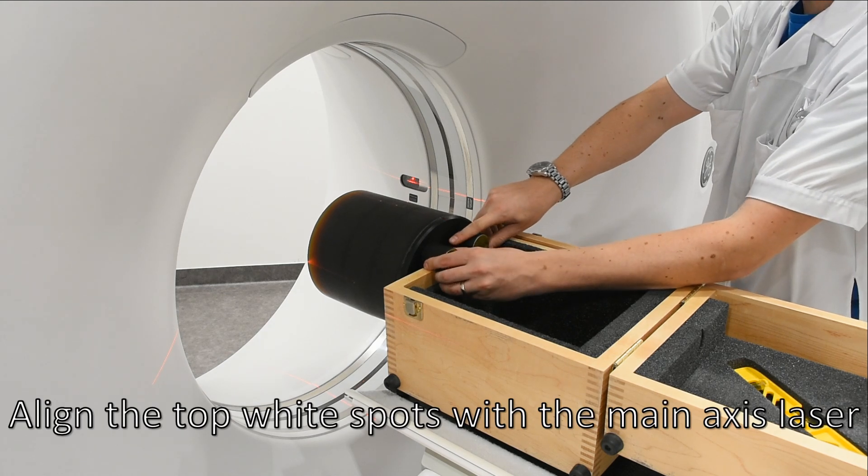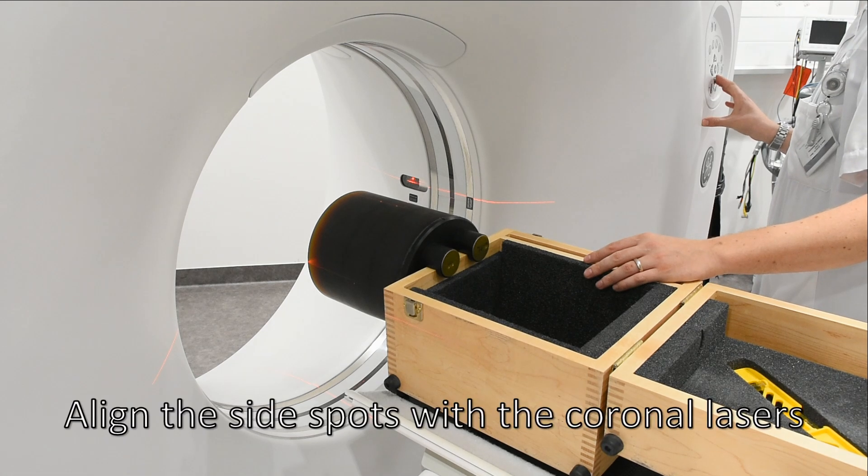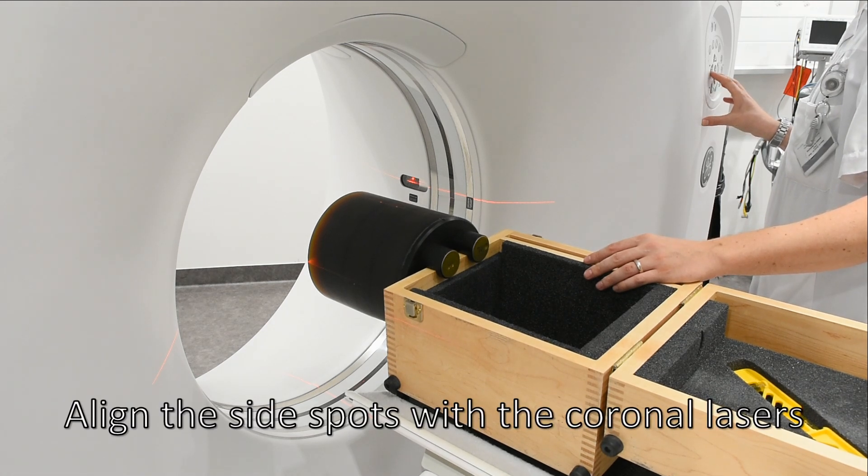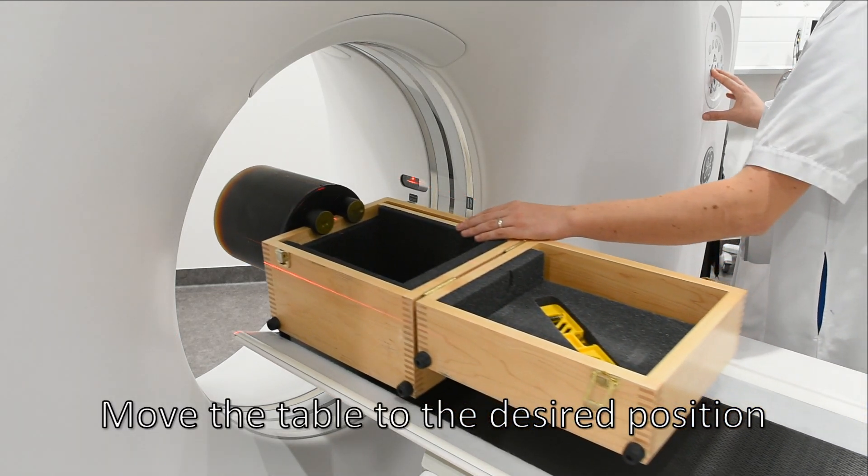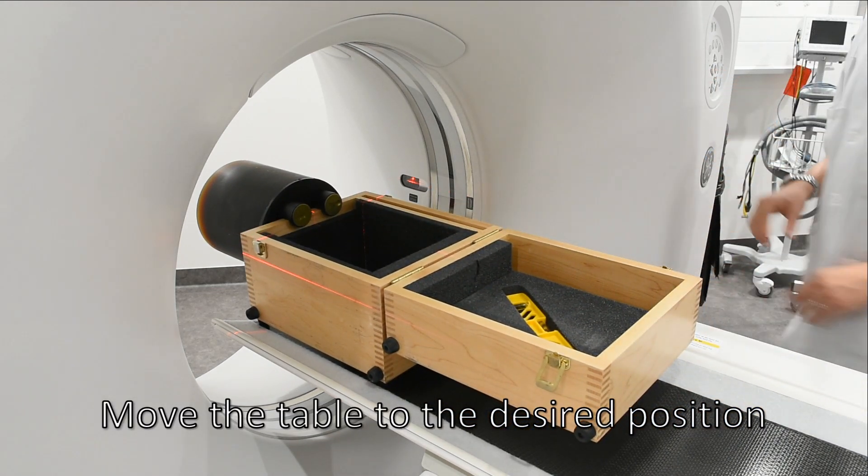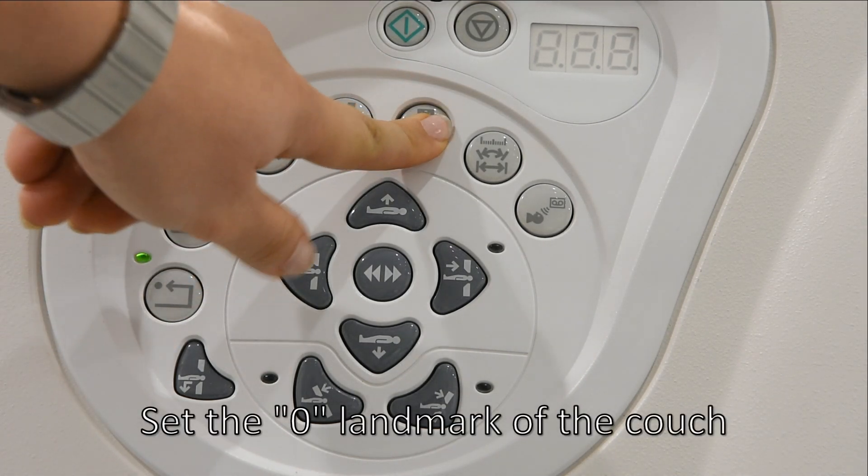Align the top white spots with the main axis laser. Align the side spots with the coronal lasers. Move the table to the desired position. Set the zero landmark of the couch.